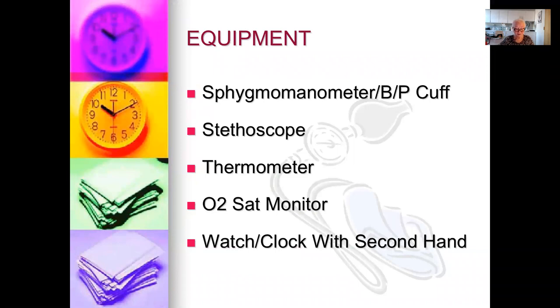All equipment we use should be cleaned and disinfected between clients. The equipment the clients use should be cleaned daily. If we have clients in wheelchairs, recliners, walkers, etc., do you know how to clean them? What is used to keep the bacteria at bay? Cleaning this equipment is our responsibility.